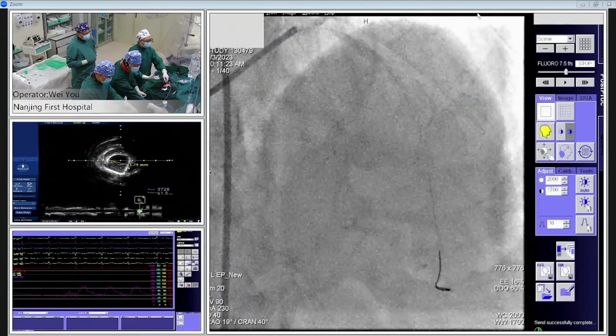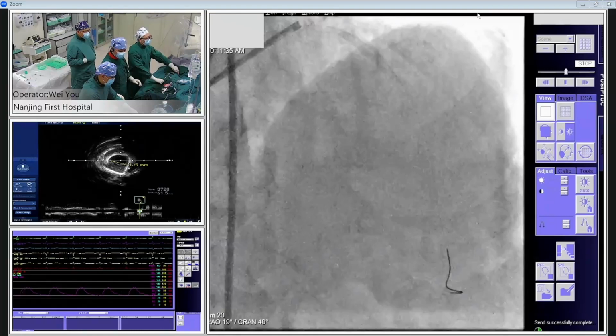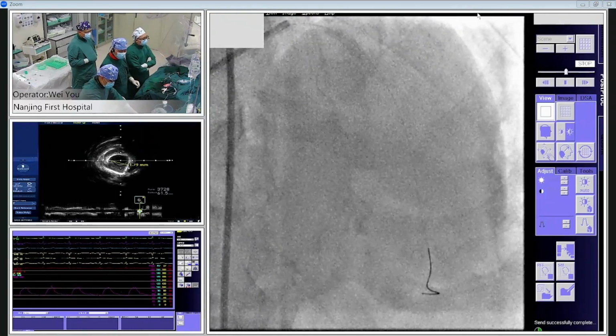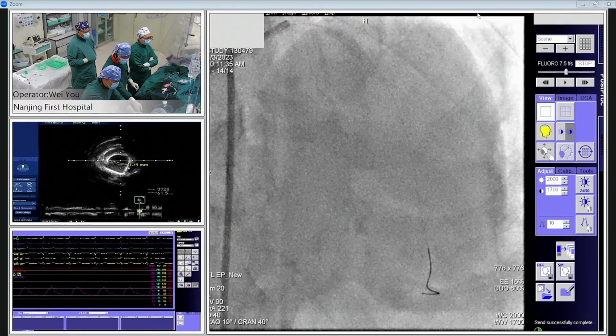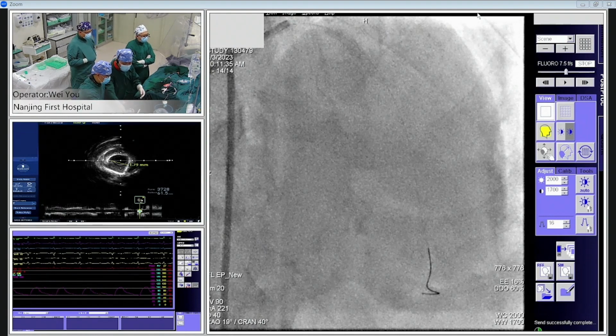The lumen diameter is larger, more than 1.8 millimeters. Give me some ATP, please. Okay. But still, I think there is a superficial calcification. The broken crack is not enough. So maybe we still need further IVL treatment to get a better plaque modification before we put a stent.